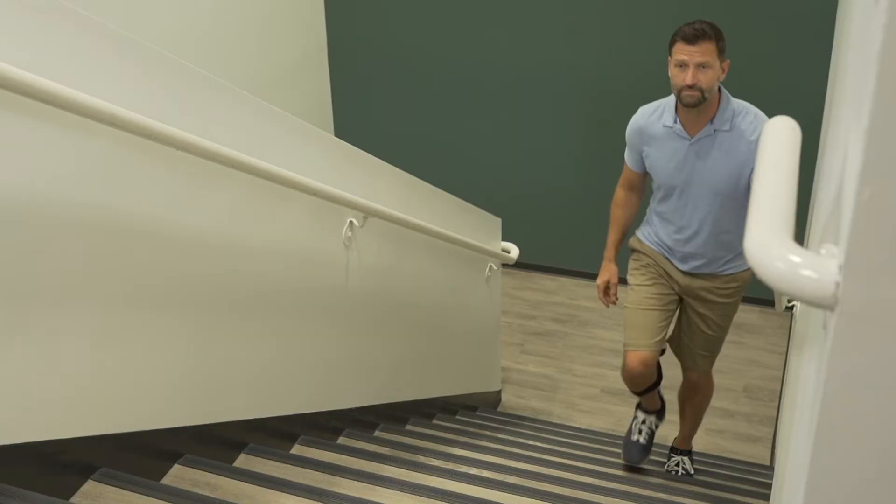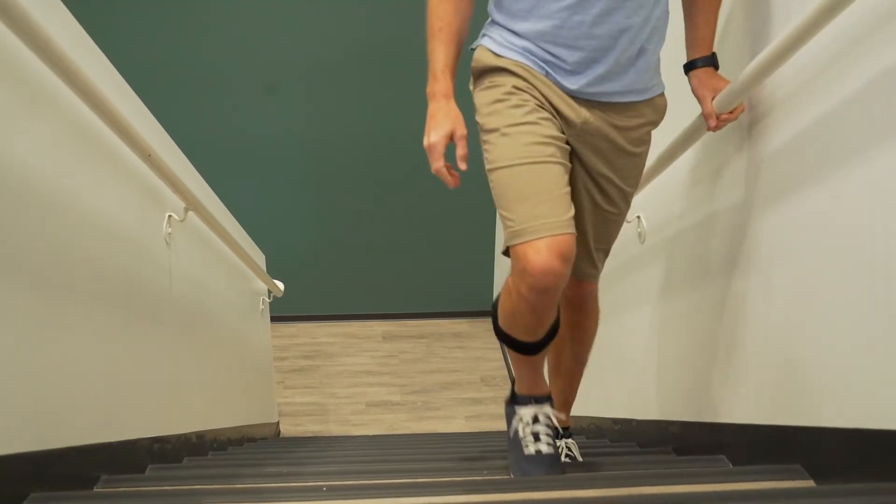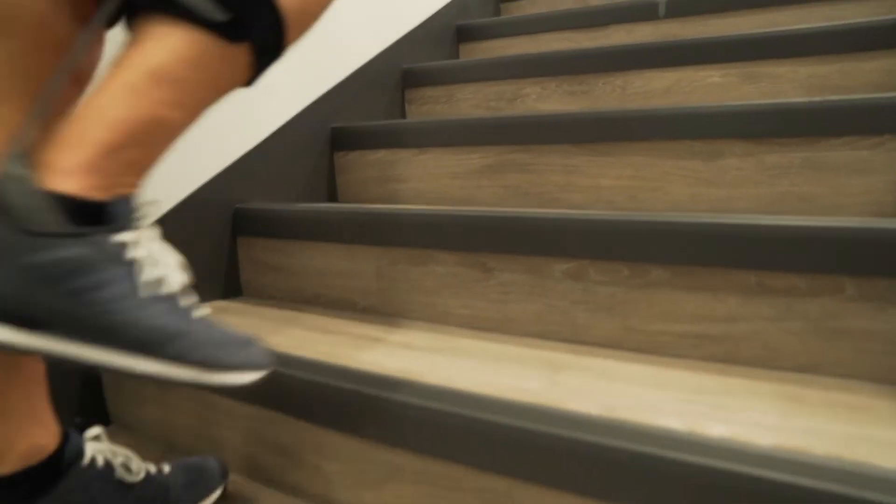The Aspen M2 AFOs are a great product. They're very lightweight, resilient carbon fiber, really thin, and fit into the shoe nicely. They're excellent at providing that toe pick-up for the patient without having them sacrifice any additional weight.